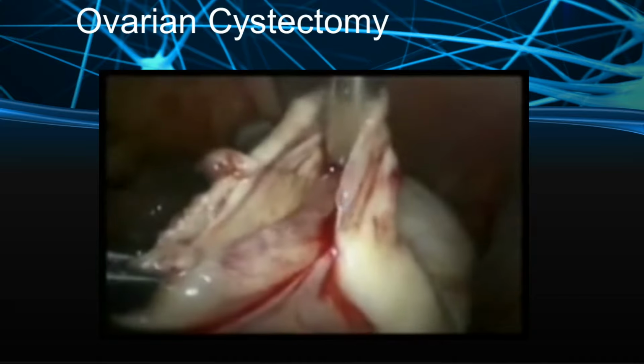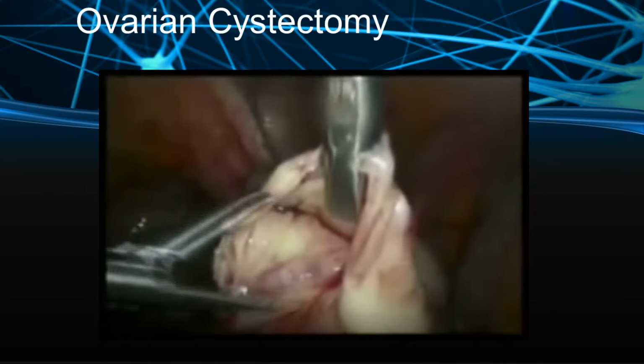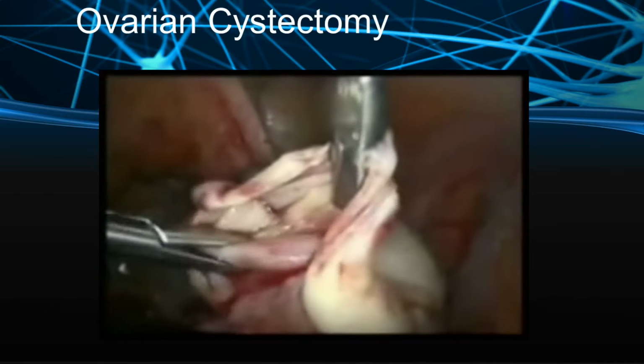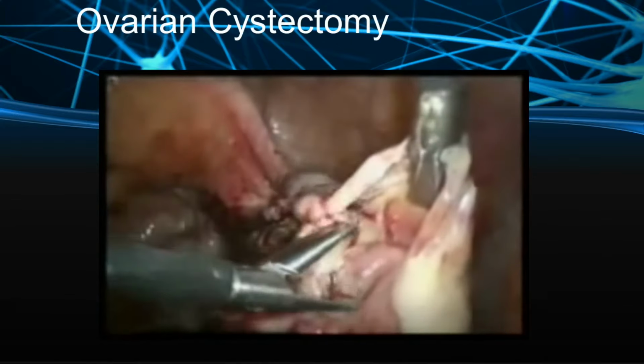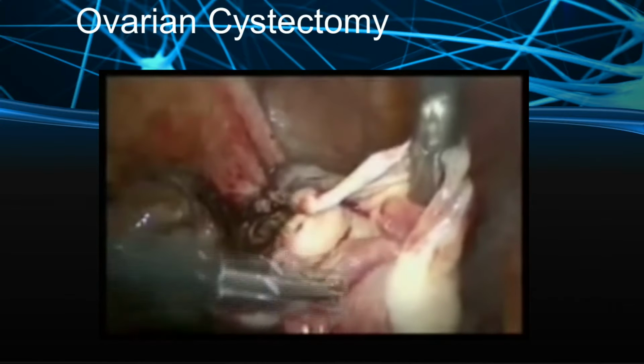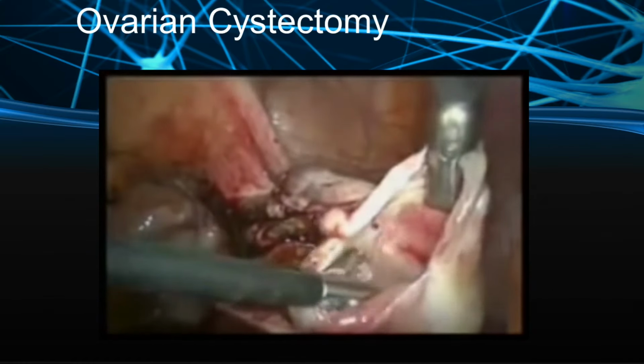This is traumatic, because a simple grasper will not catch, it will slip. This is a traumatic tooth grasper, that is mandatory, because if you want to do it with an atraumatic one, it will keep on slipping. Your grasper also may be damaged.